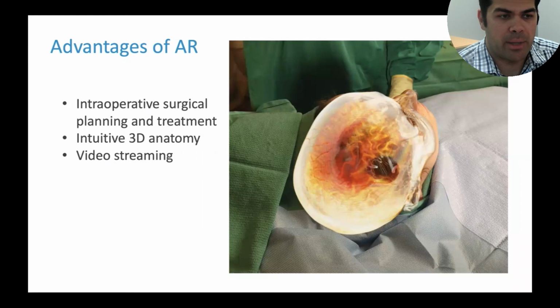Augmented reality also has tremendous application for intraoperative use. We can use it for planning and surgical treatment, again, taking craniotomies planned preoperatively and deploying them in a surgery environment. We can use it to identify 3D anatomy and better understand how patients' anatomy maps onto their head or any other part of the body for that matter.